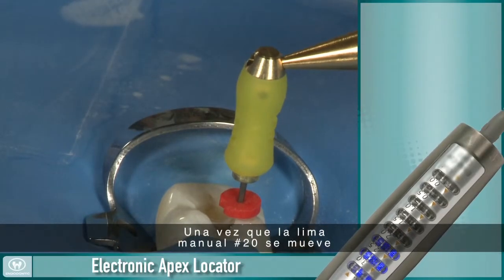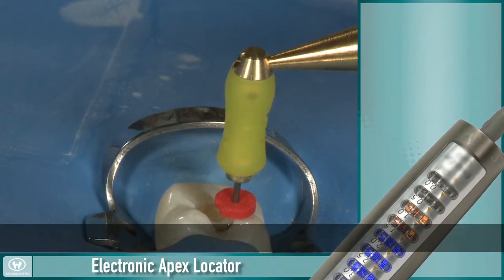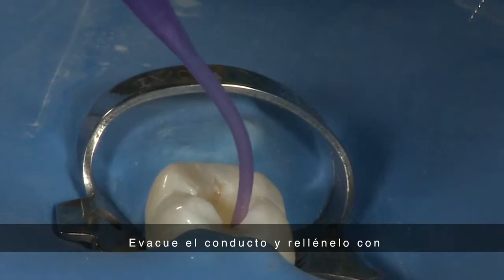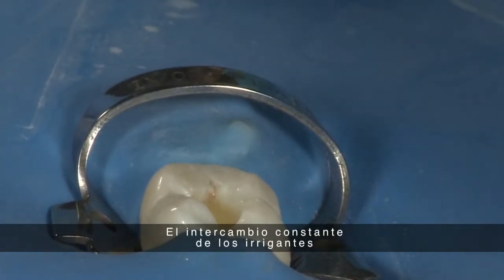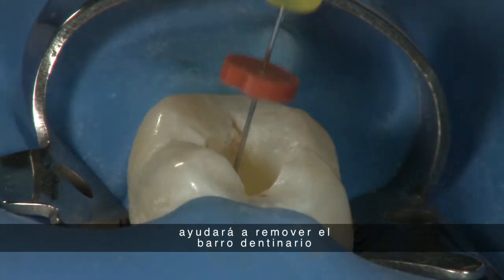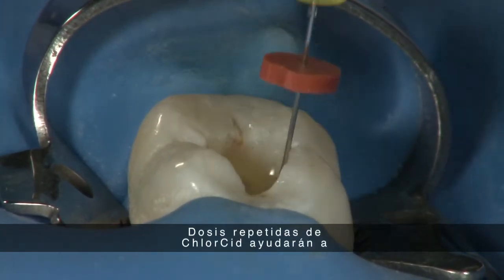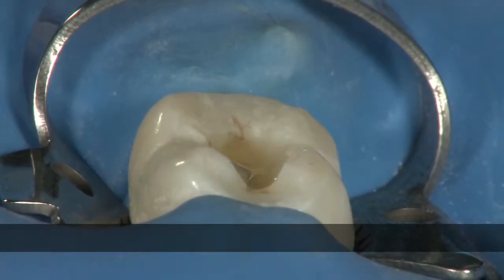Once the number 20 hand file moves freely in the canal, you should reconfirm your working length with the electronic apex locator. Evacuate the canal and fill it with fresh Chlorocid. Constant exchange of the irrigants will help remove dentinal mud and other debris from the canal. Repeated doses of Chlorocid will help to break down all organic matter within the canal.